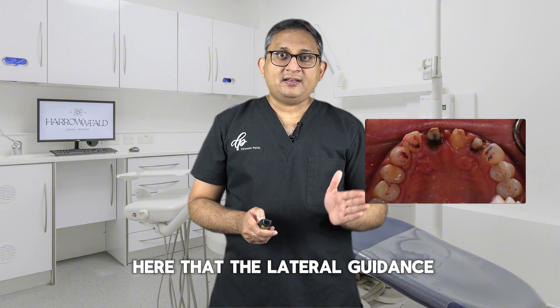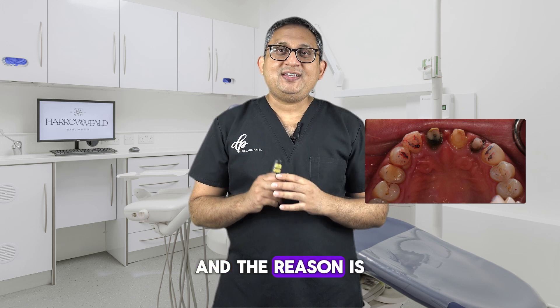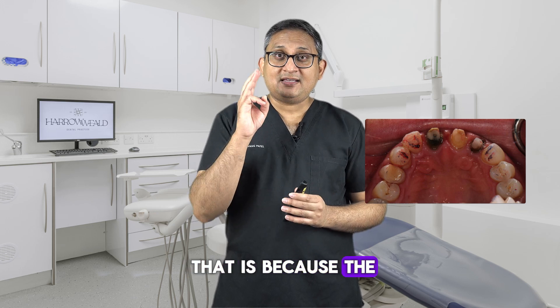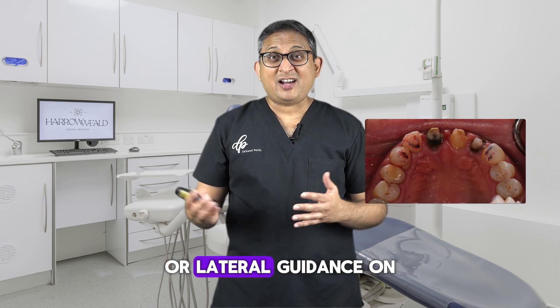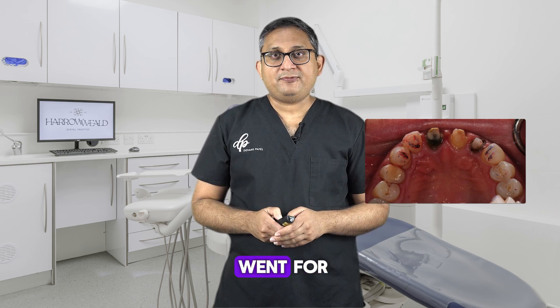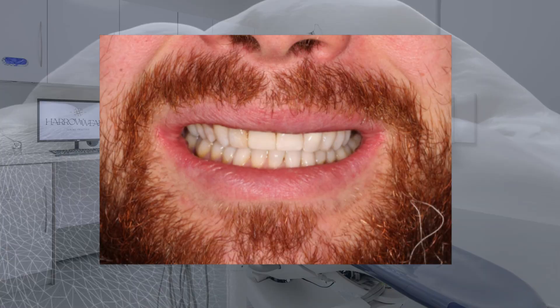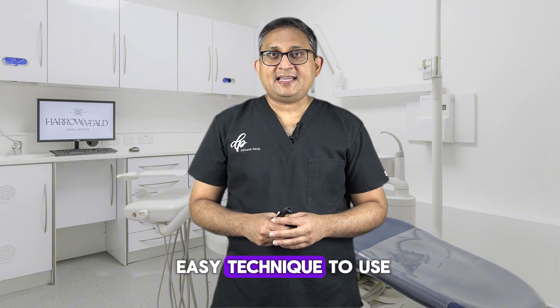On the right side of the photo, the canine has two lines — the canine is doing both lateral and protrusive guidance. The reason is that the anterior front three teeth are all post and core restorations. I don't like to have protrusive or lateral guidance on post and core restorations, and I didn't want to change them. That's why I went for this guidance. The restoration was completed and the patient is quite happy — and no OVD was raised.